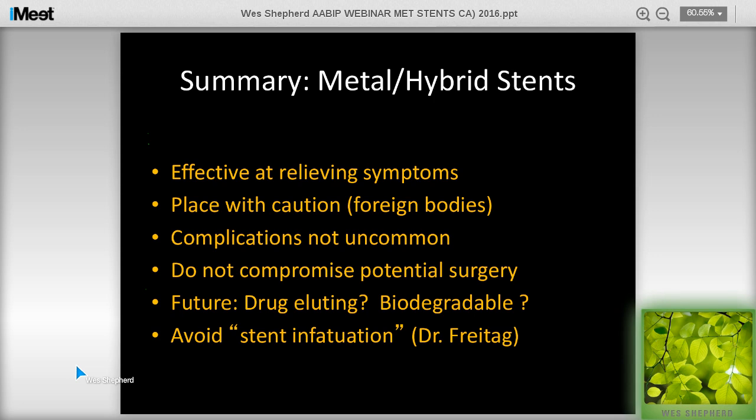If you're putting in a main stem stent, I certainly have had cases where I thought I was going to be able to open up the whole lower lobe or multiple segments, and on further investigation and debulking, I find that I may be left with a couple of basilar segments, or 2 or 3 basilar segments. And in those cases, sometimes I will err on the side of going ahead and placing a stent that may even begin in the distal lower lobe, possibly only leading to 2 or 3 basilar segments, and then extending up more proximally, covering the disease.